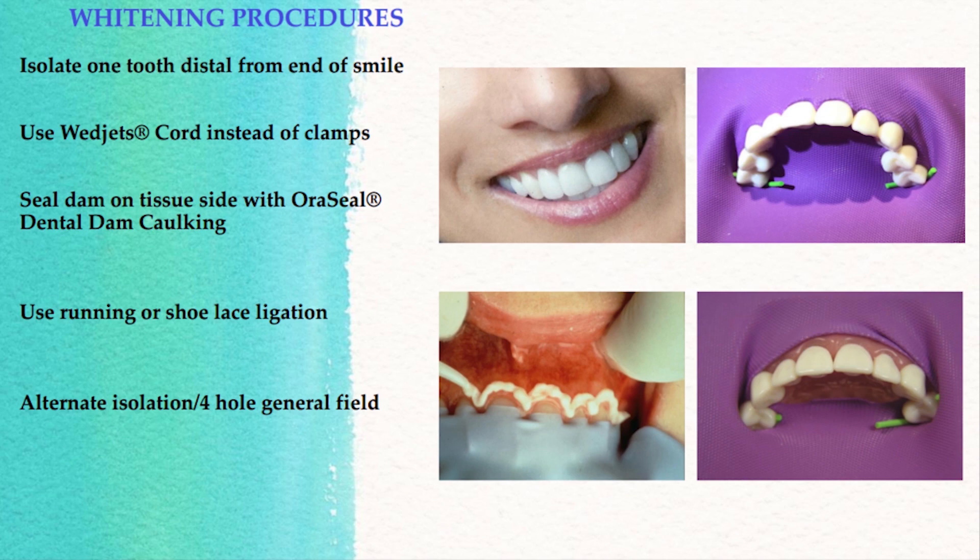I also recommend using wedged cord. In our clinical case today, we're using wedged cord to isolate at the ends of our isolation instead of using a clamp — it's more comfortable to the patient. On this side we ended up at the premolar; we went a little extra on the other side. We're also using a framed flex-a-dam, and what's nice about that is the frame is integrated. It's much more comfortable for the patient and it expedites the procedure.